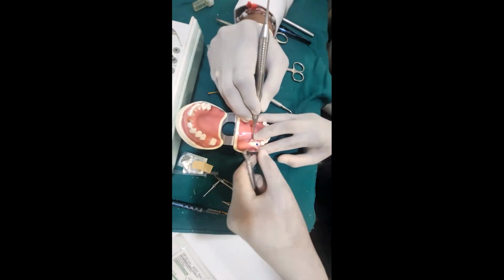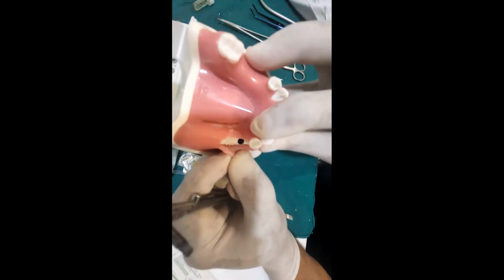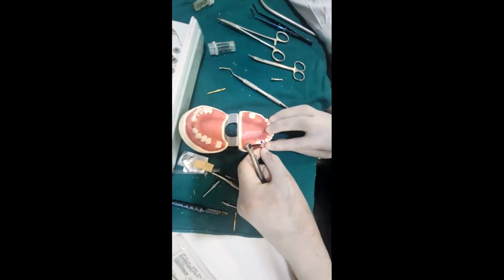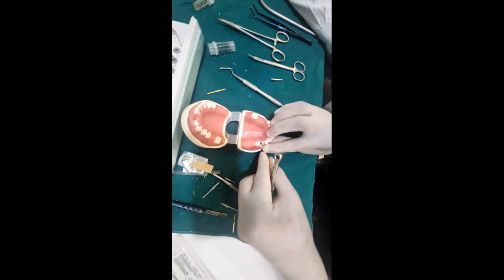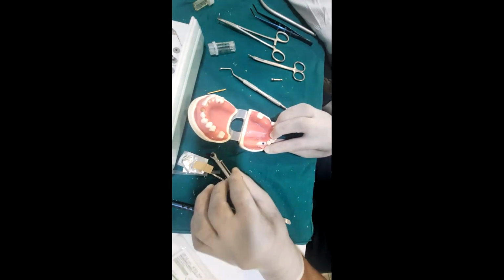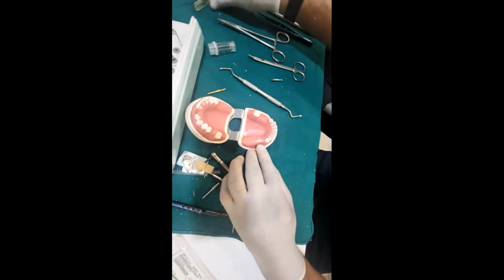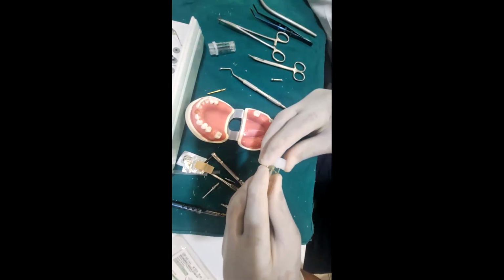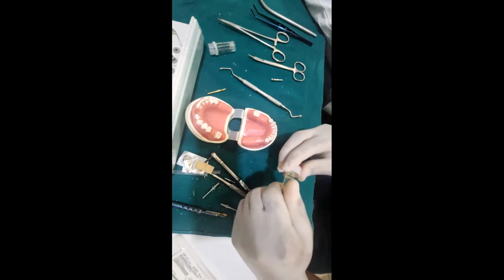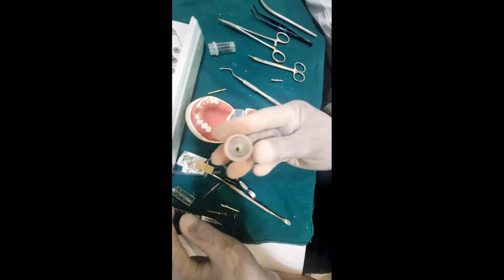Your implant is placed. You can see it is just a millimeter subcrestal, and that will ensure that even if there is a millimeter of crestal bone loss due to damage of the drills, you will still have implant which has healed at this level. The second thing, as I had mentioned, is the cover screw.